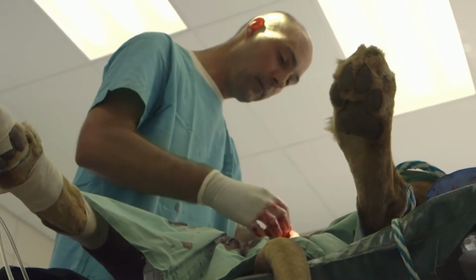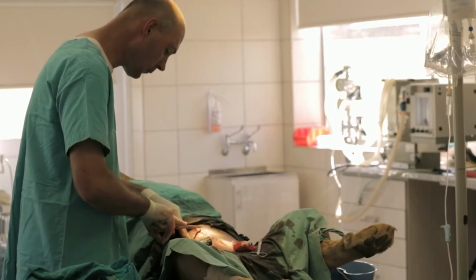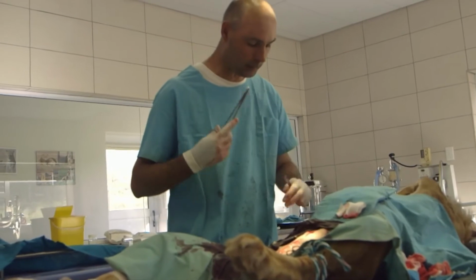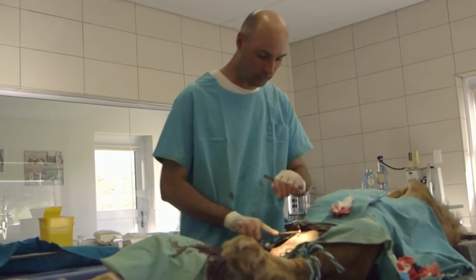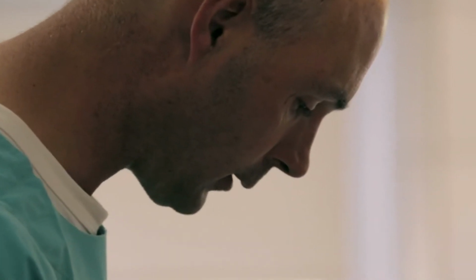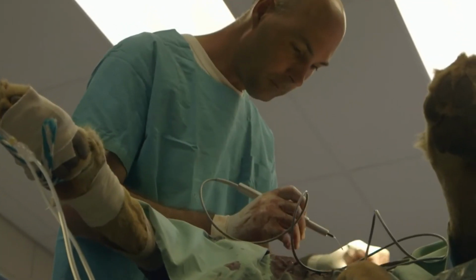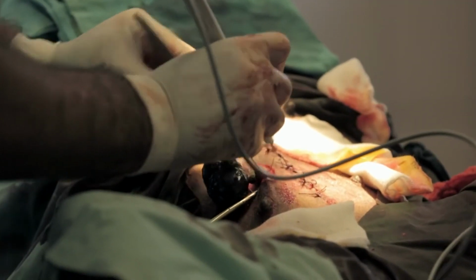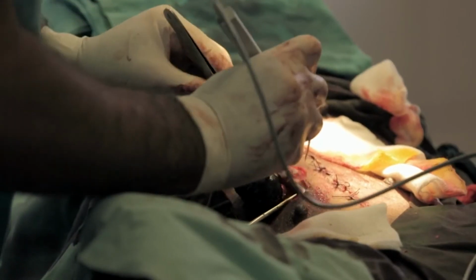Dr. Caldwell has managed to isolate and tie off the problem blood vessels. Simply removing the tumour, but not the blood vessels, would have increased the chance of new cancers growing. We explored the whole abdomen and found 2 branching blood vessels on either side to this growth here that I'm going to remove now. So the surgery is not done yet. Dr. Caldwell uses a cauterizing tool to cut around the tumour. I tend to like to use this, especially if there's cancer involved, because you don't want any excessive bleeding and spread of the cancer.